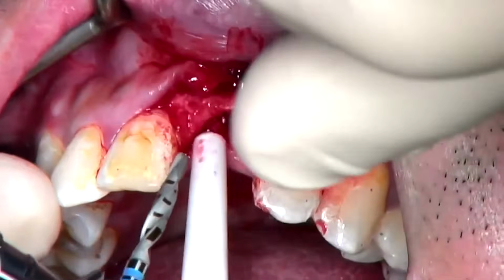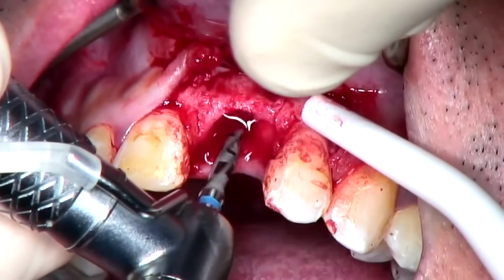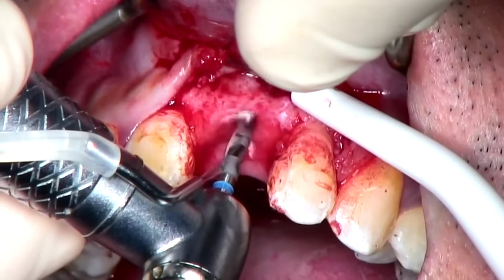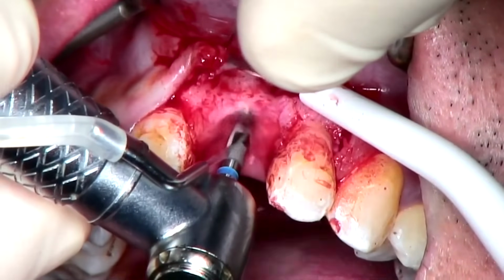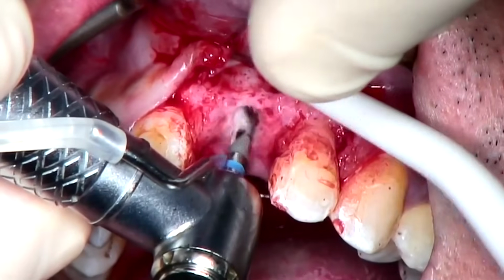Having achieved full access to the bone defect, a round burr is used to locate the implant position, and then we can start our osteotomy with the first drill, which in this case is 2.2 millimeters in diameter.